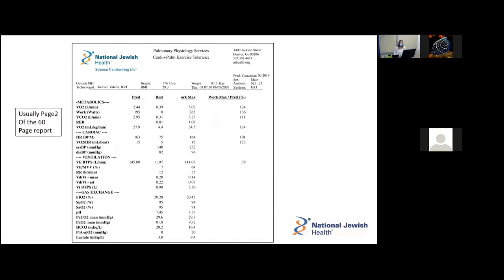Once the test has been completed, a report is generated. Unfortunately it can be very intimidating — the whole report is usually about 60 pages. I would direct non-experts to page two or three, which contains patient parameters and demographics at the top, and then all parameters measured during the test: metabolic, cardiac, ventilatory, and gas exchange. All of the predicted values are listed, based on height, weight, age, and gender, along with values at rest, values at maximum work, and the percent predicted.